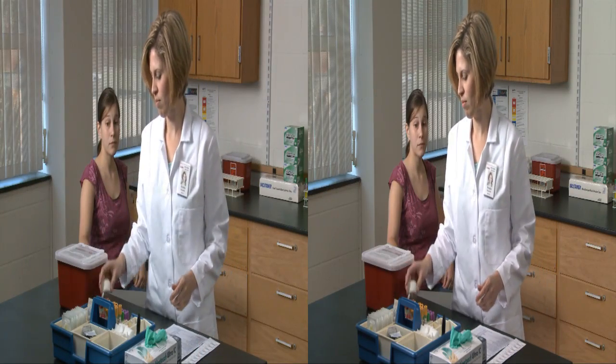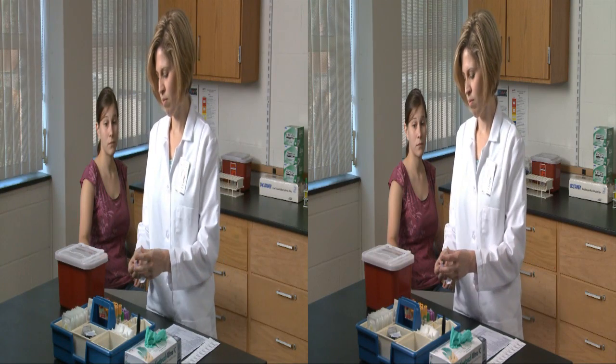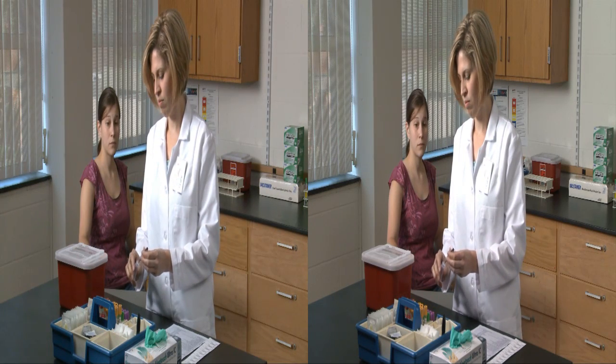Blood collection by venipuncture is one of the most common procedures performed in a health care setting. Common, but also complex, requiring knowledge and skill to assure the accuracy and integrity of the samples drawn and to eliminate risk to both patient and health care workers.